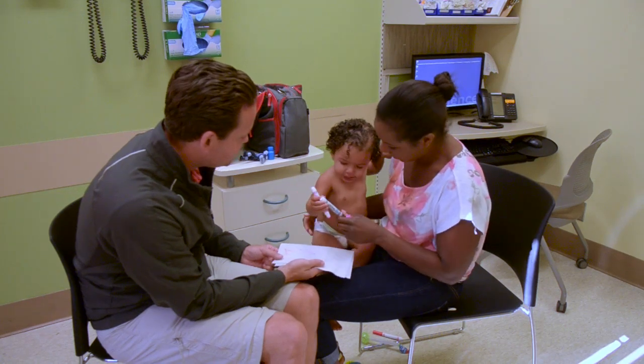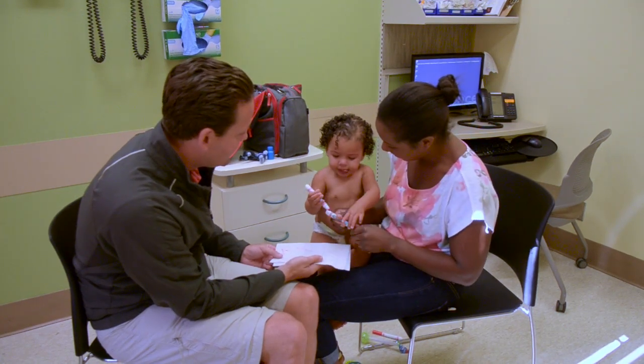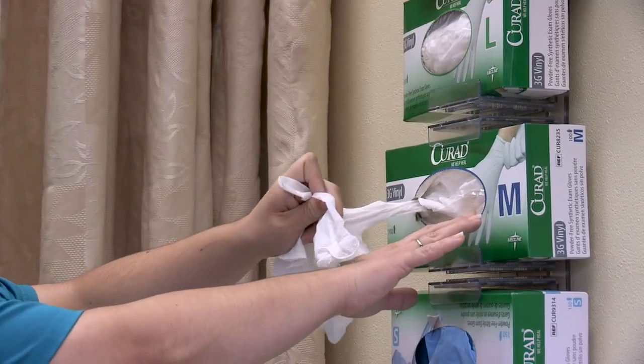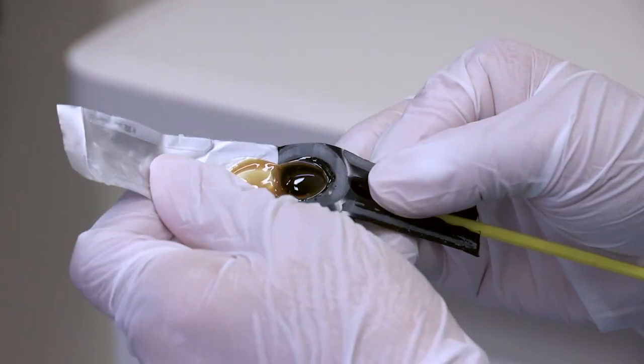Either a medical assistant, nurse, or health care provider can apply the varnish. You will need gloves, gauze, and the fluoride varnish single unit vial with its brush.